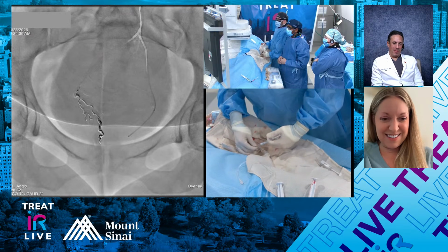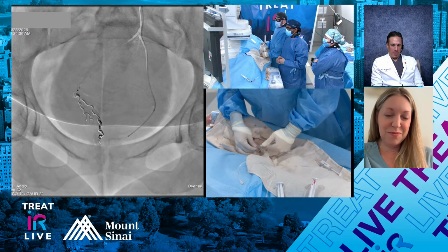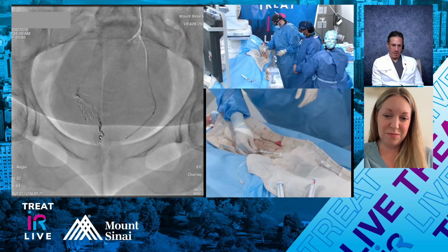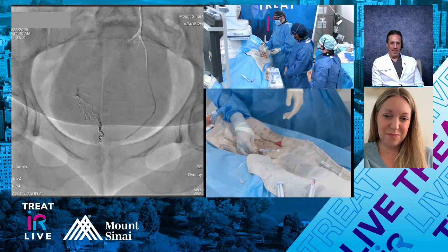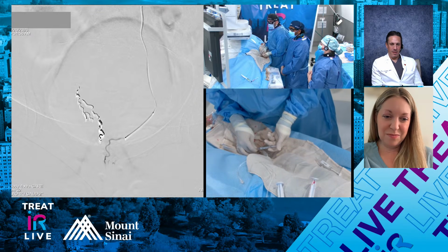That's another area where I think we're seeing a lot of improvement, because more and more we're getting into procedures where we can use angled microcatheters. And this is definitely a space where there's a future where we may not need a wire at all, as Jay has expertly demonstrated. With an angled microcatheter, there's a world where the right one can just take care of this whole procedure for you.